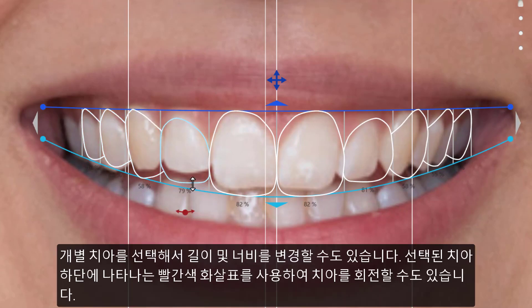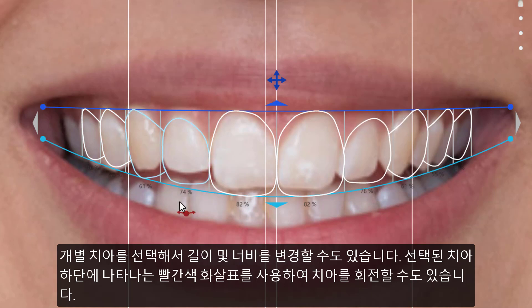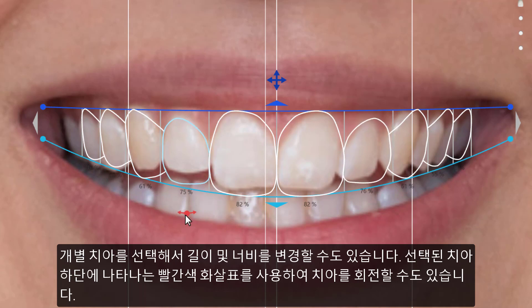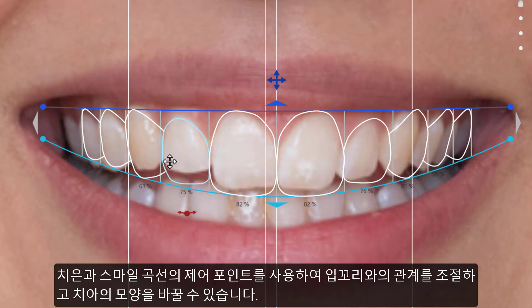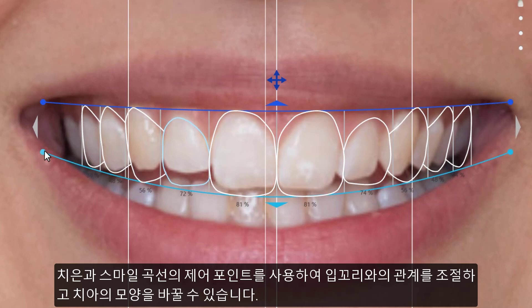You can also change the length and width of any individual tooth by selecting it. When a tooth is selected, you can rotate it using the red arrow that appears below the selected tooth. Lastly, use the gingival and smile curves control points to adjust the perspective of the teeth outlines in relation to the commissures.